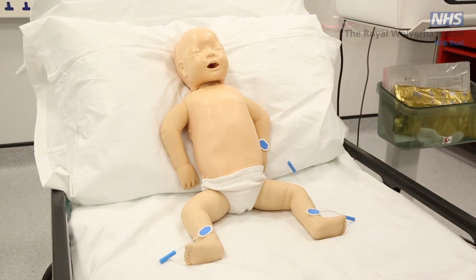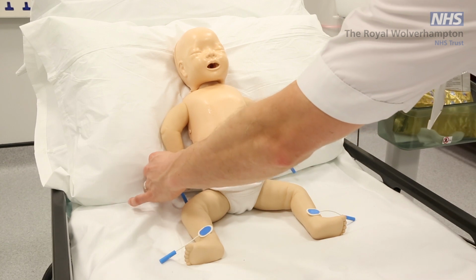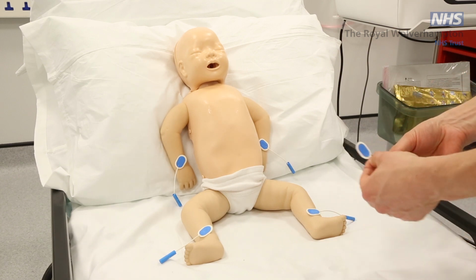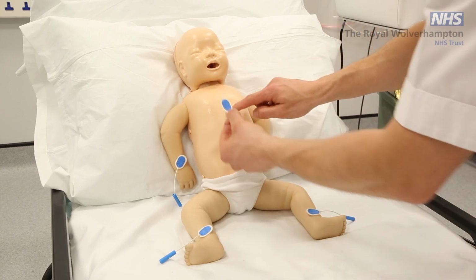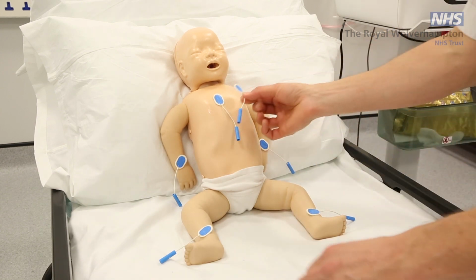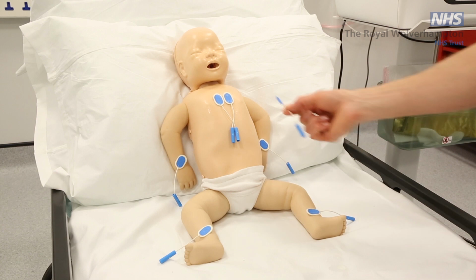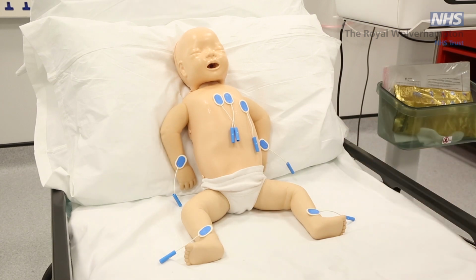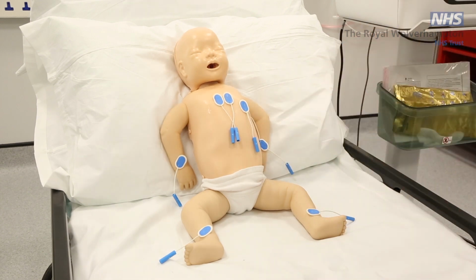The 4 limb electrodes are attached as previously described. The chest electrodes are normally positioned as previously described, but additional leads such as V4R, V5R and V7 may be recorded at the request of a clinician or according to local policy. Whilst practice is variable in the routine use of right-sided chest leads when recording ECGs on children, it is not uncommon to find V4R used in infants up to 1 year old. Practice is determined largely by the indications for the ECG and clinician preference.